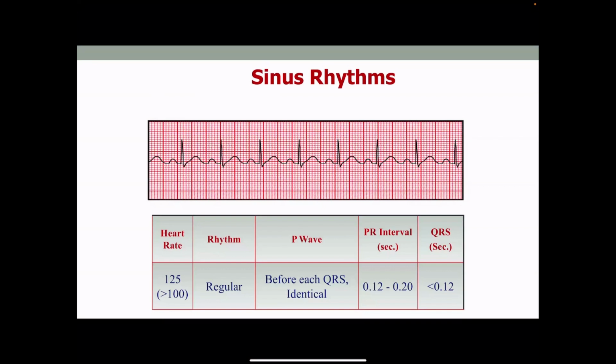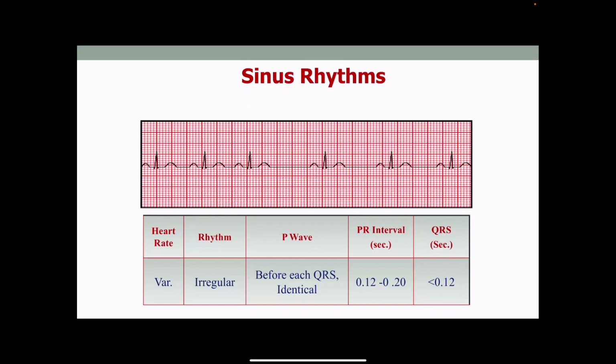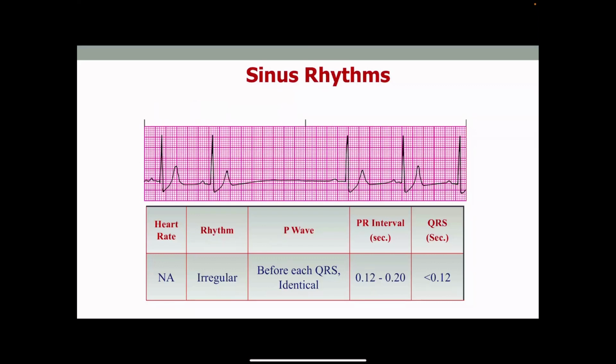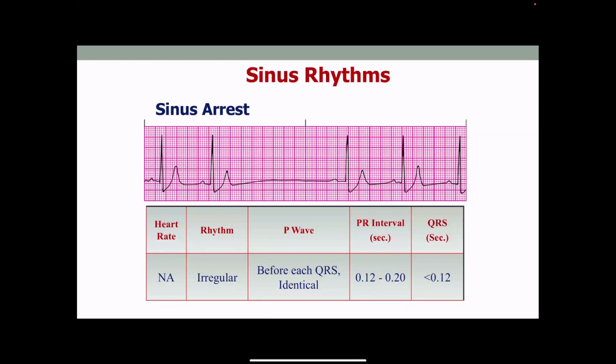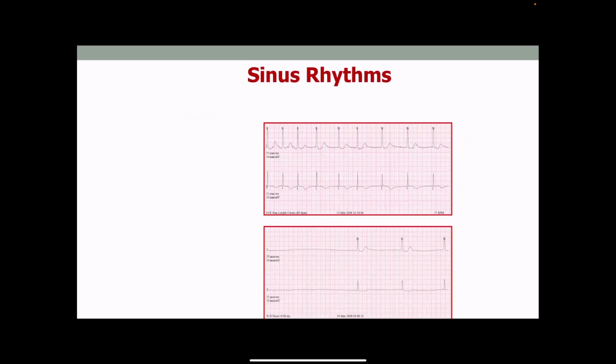Okay, yalla, what's this one? Sinus tachy. Exactly. What about this one? This one is a premature one, right? I agree. It's sinus arrhythmia, but I agree, yes. What about this one? Arrest. Yes. Okay, yeah, you can call it arrest and pause. Okay, cool. What about these?